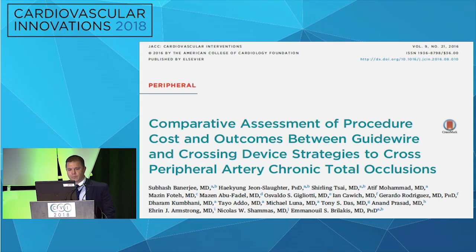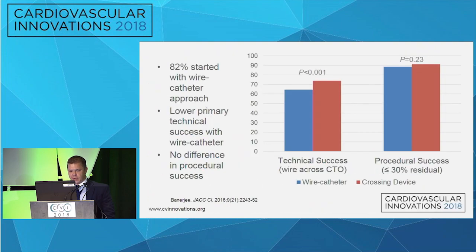This is a really seminal paper recounting 10 years of experience from 11 U.S. centers and over 1,300 patients that Dr. Banerjee and his group, leaders in this field, have put together, many of whom are on this panel today, looking at the comparative effectiveness, essentially, of crossing strategy.